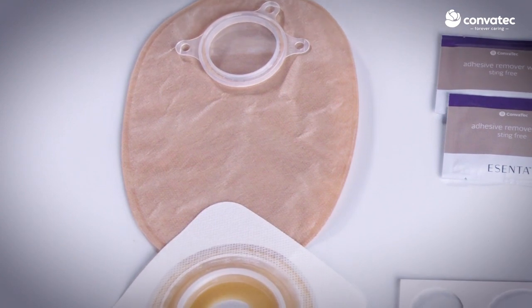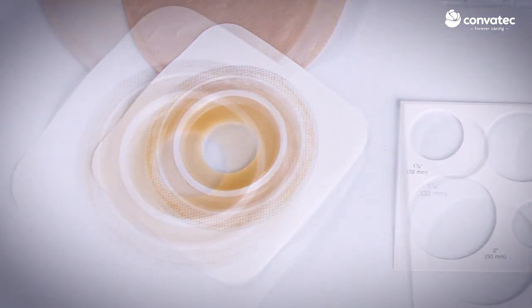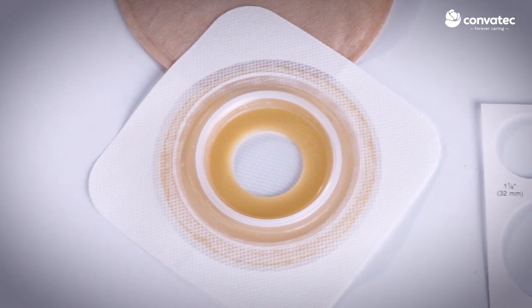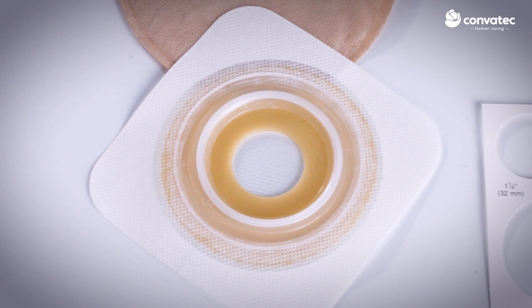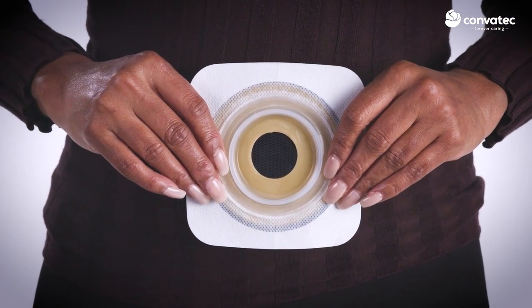Here, we are using a two-piece system with a mouldable base plate, a special pliable adhesive that can be rolled back to a custom opening, tailored to the size and shape of your individual stoma. There are several components to the mouldable base plate we will review.